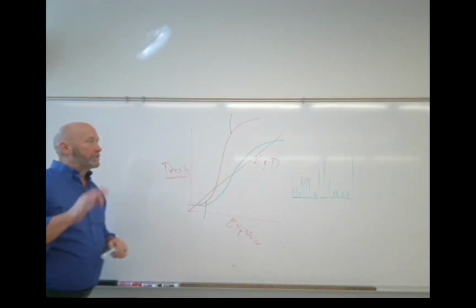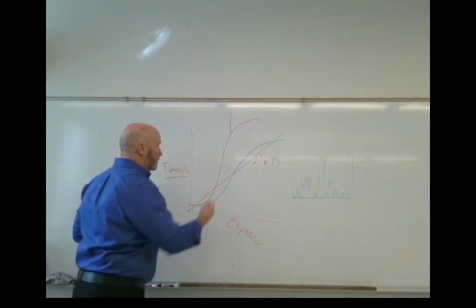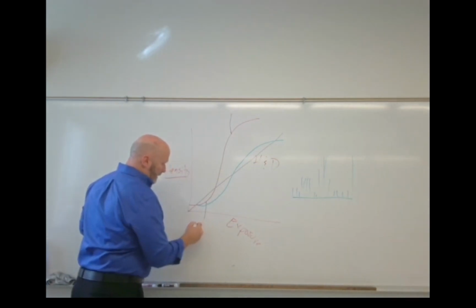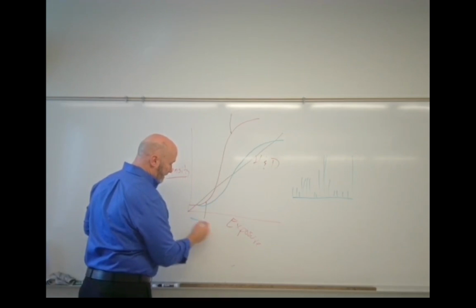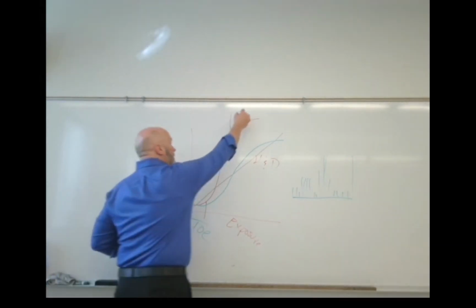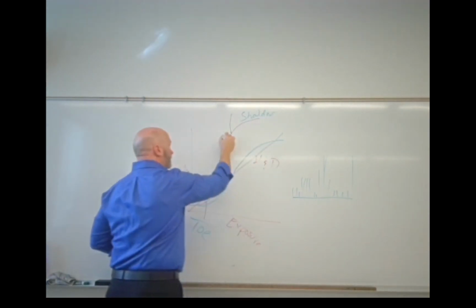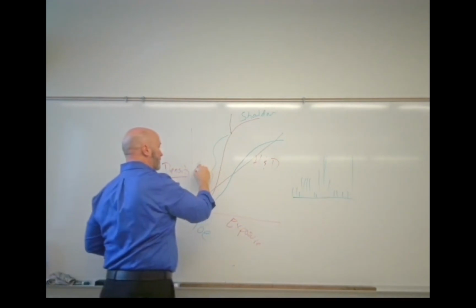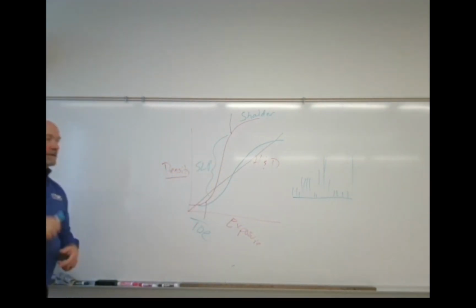Okay, so there's three portions of the H&D curve. At the bottom, you look down at the ground, what's the first thing that you see that's attached to your body? Toes. Toe, right. So that's the toe portion. This would be the shoulder portion. And then this area through here would be the straight line portion. The straight line portion describes your contrast. To a degree, it describes your speed.